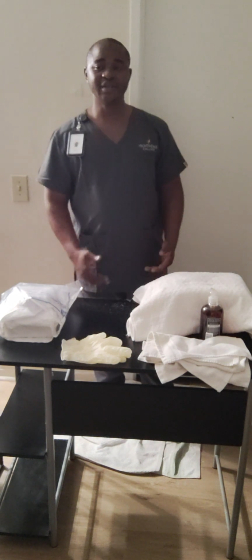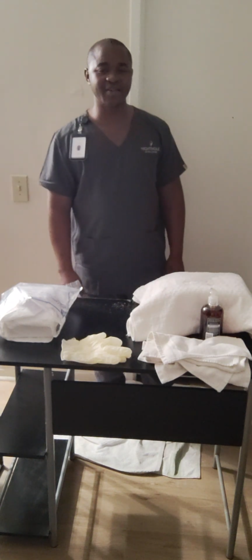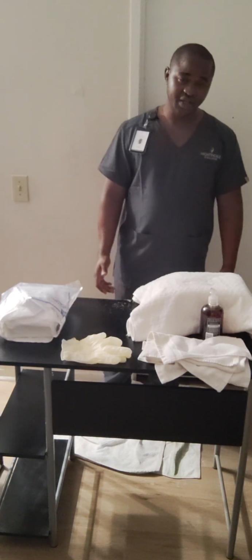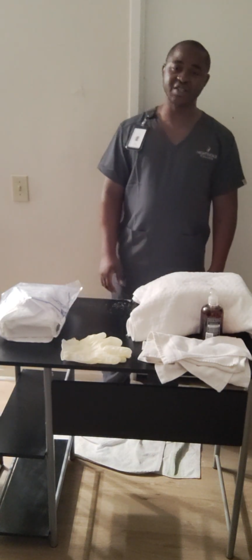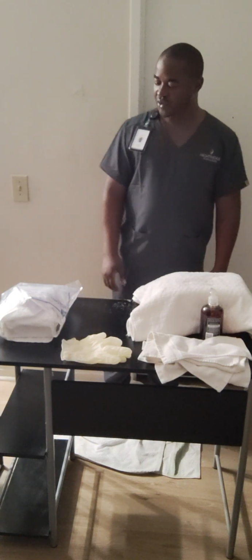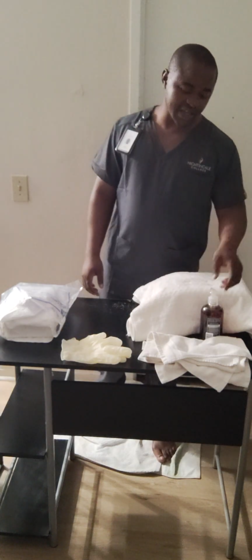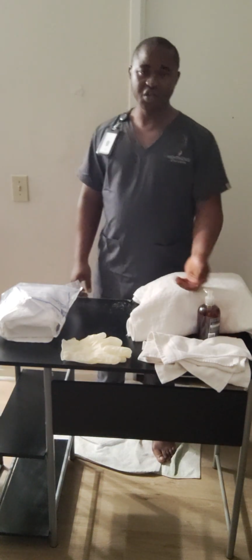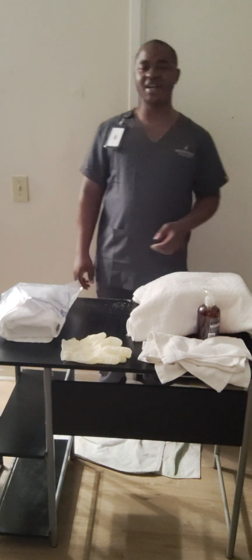I'll go ahead and ask for their name and date of birth using the two-step identifiers. What's your name and date of birth? Tell me their name. I check their wristband to make sure that it matches the patient. We have the right patient, and at this time we're going to go ahead and start our procedure. I will perform hand hygiene again in front of the patient to make sure they are comfortable, and I will ask if they have any allergies.